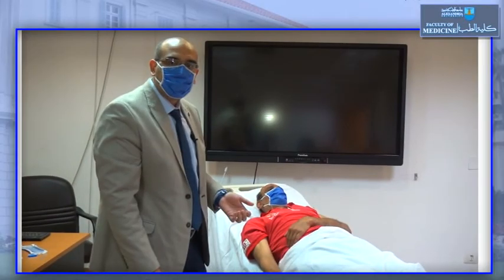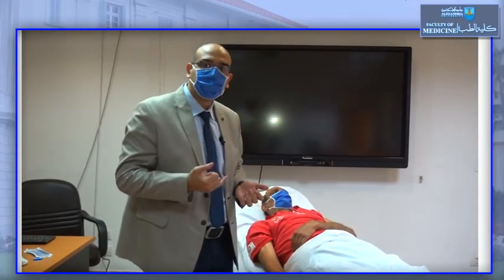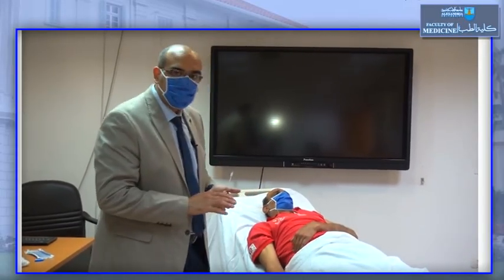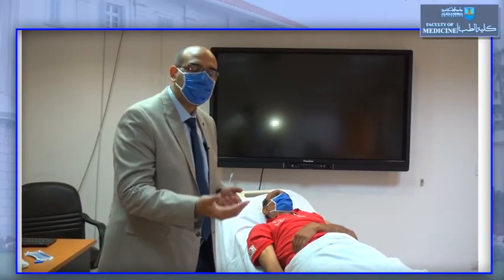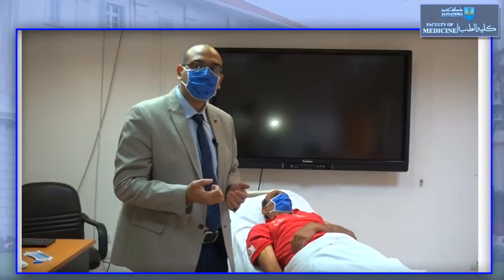For axillary measurement, we should add 0.5 degree. If we use the oral method and we put the thermometer below the tongue, it is the same reading, but in the axilla we increase 0.5 degrees, or in the rectal method we decrease 0.5 degrees.